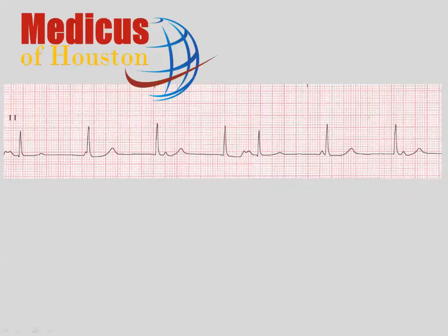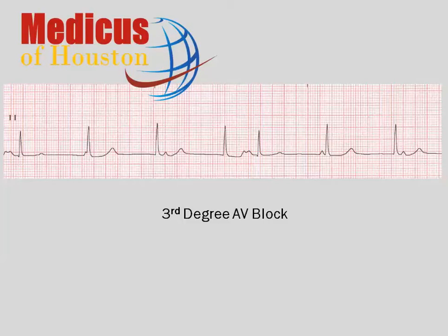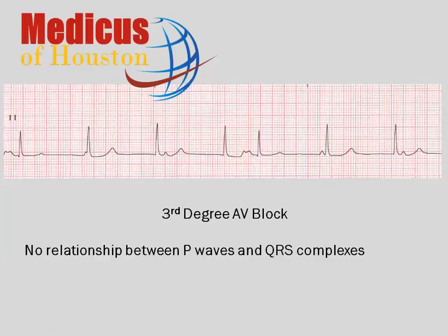Let's look at this lead-two rhythm strip. Is this third-degree AV block or AV dissociation without block? What do we look for in third-degree AV block? First of all, as everyone knows, we look for a rhythm in which there's no association between P waves and QRS complexes. Unfortunately, that's really about all most people know, and it really doesn't help.